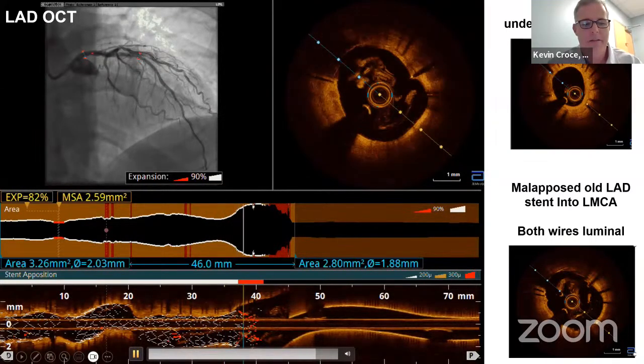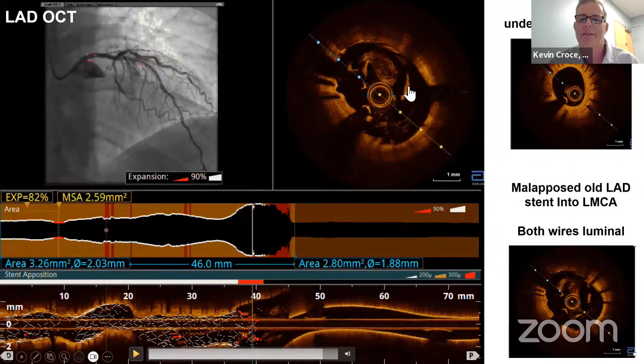That was my thought to you, Suzanne. Looking at this stent folding across the LAD and the fact that the LAD was sick already, I was thinking I'm going to try to remediate the bifurcation. He was a young guy. Bypass surgery might be in play, except that until I crush the LAD, I don't have enough LAD disease to warrant that at this point.